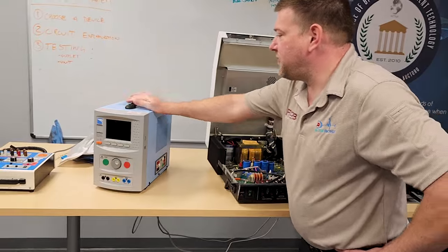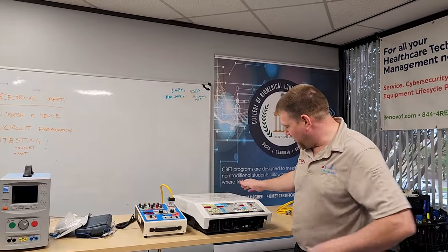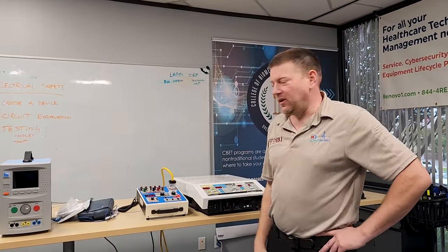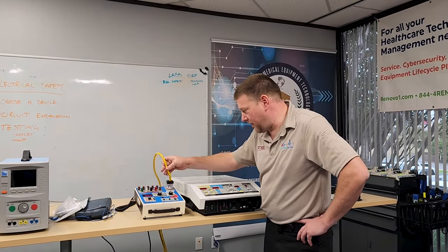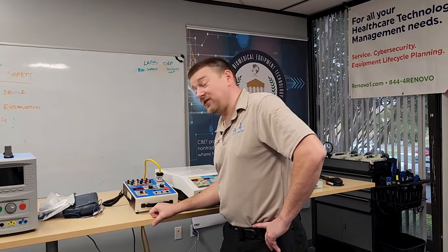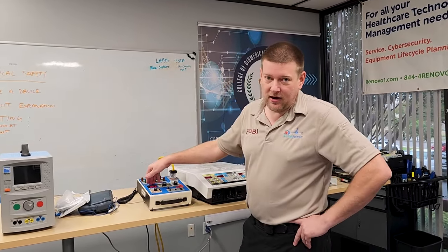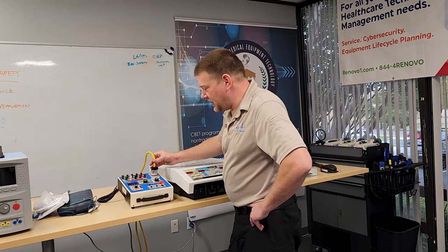Let's go ahead and set it up with the Rigel Unitherm. Before we plug a medical device into a very expensive piece of test equipment, we're going to do an electrical safety check first — we want to make sure this case isn't leaking a lot of electricity. For electrical safety, the first thing you always do is your ground check. The device is currently connected and we move around both ends of the cable to see if the reading changes.